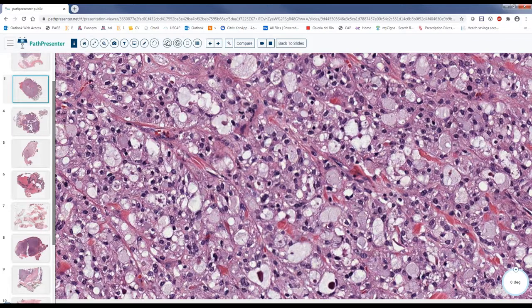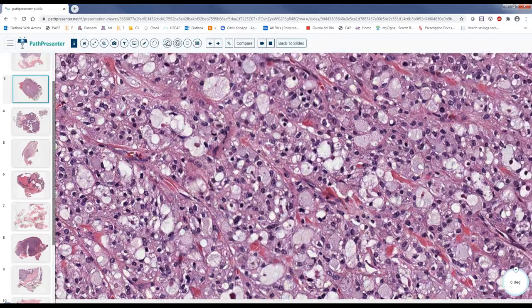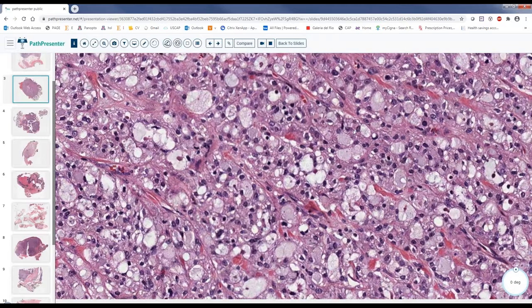It is pinkish. So when you see pinkish material, what do you think? Yeah, that is a good one. Usually it is proteinaceous material, including the milk, because under H&E it is pinkish.